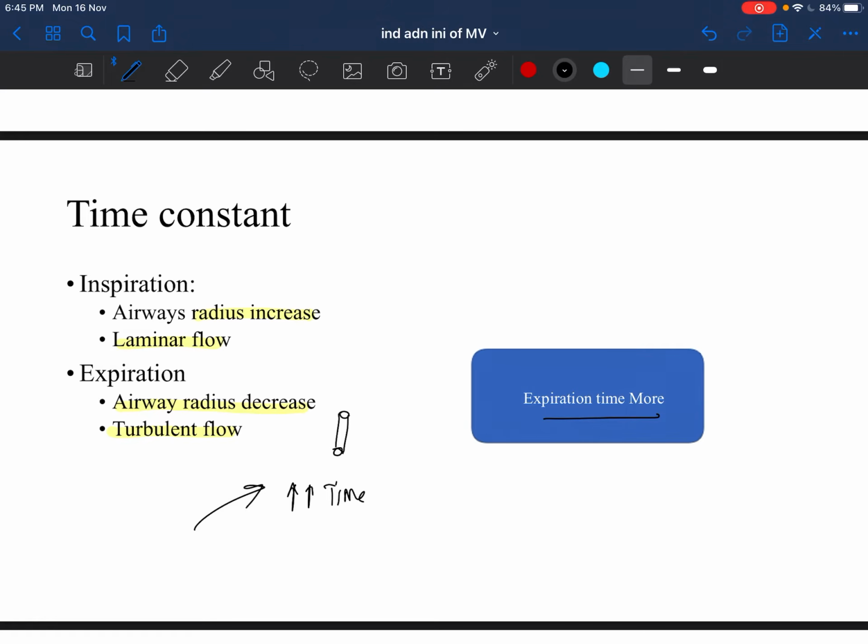Alright. So this is what we discussed earlier also. If you remember, in one of our beginning classes, basics of ventilation part 1 or part 2, I am not sure which, I think it is part 1, we discussed this concept of time constant in relation to compliance and resistance. So I will just touch upon it once again. Time constant is compliance into resistance, or in other words your Ti. Five time constants is 1 Ti, 1 inspiratory time, isn't it? So that is what your calculation is going to be.